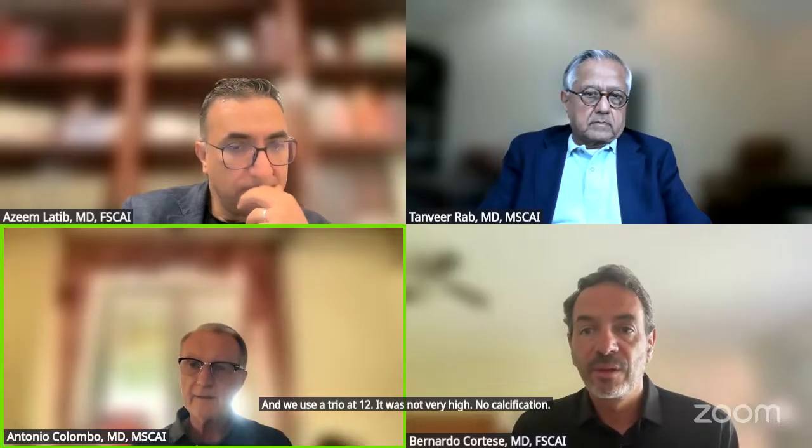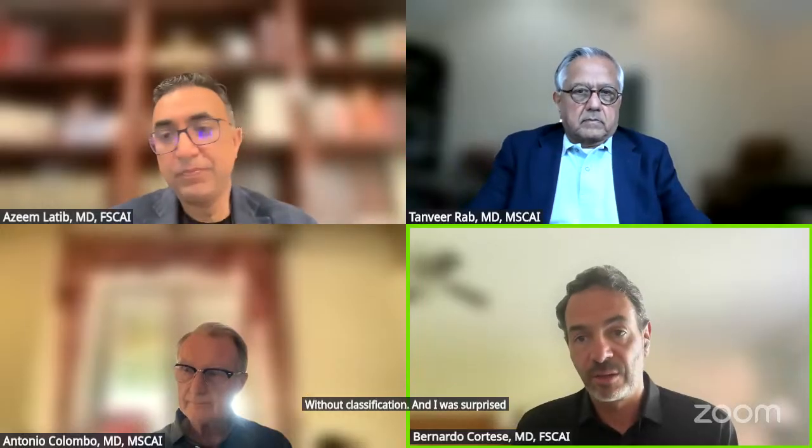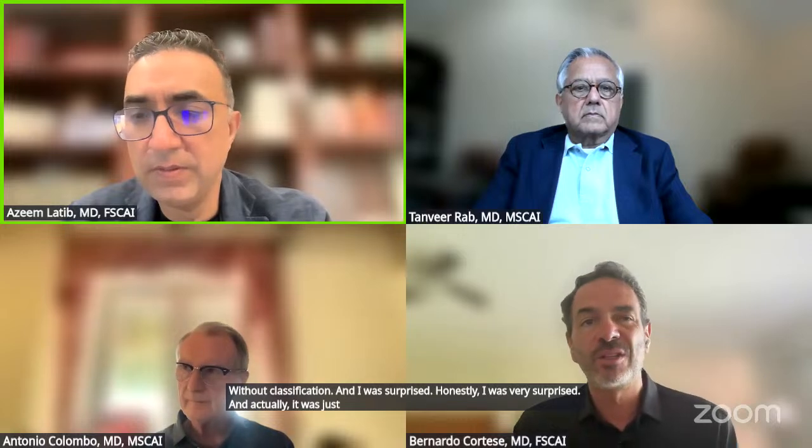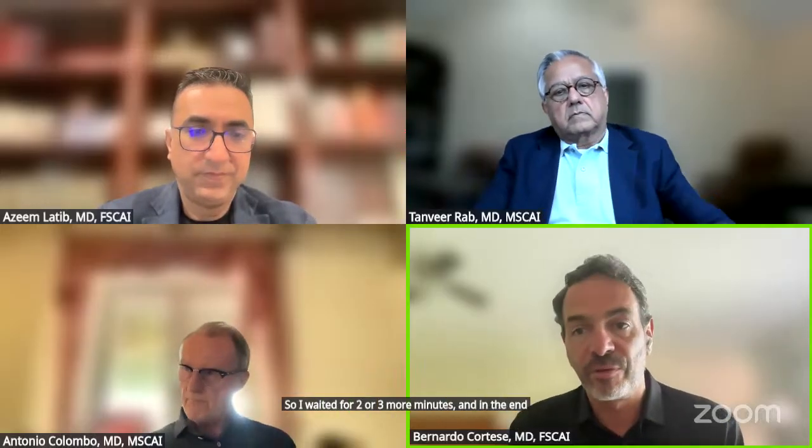No calcification. And it was an ISR. Yeah, it was distal. It was an edge ISR, so that occurred just distally to the stent, without calcification, and I was surprised. Honestly, I was very surprised. Okay. And actually, it was just after cutting, there was a dissection, a nasty dissection. Yeah. So I waited for 2 or 3 more minutes, and in the end, it was a perforation.